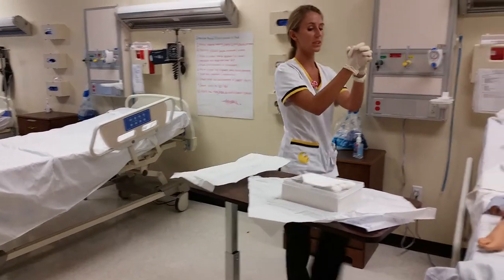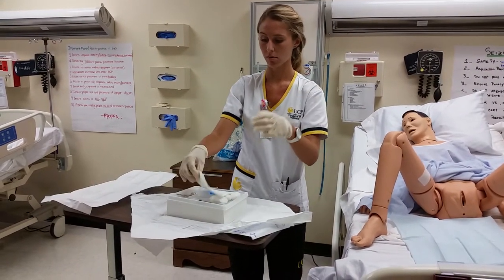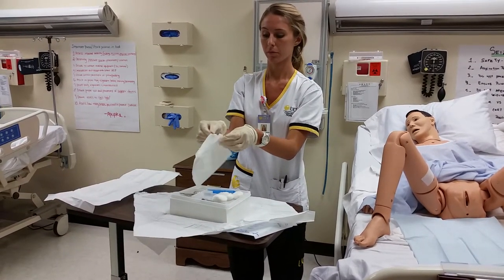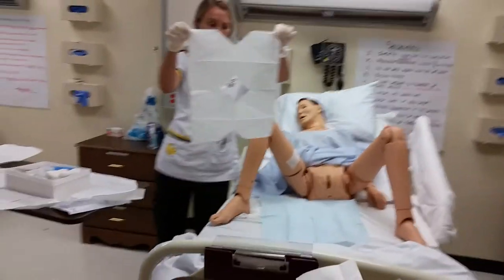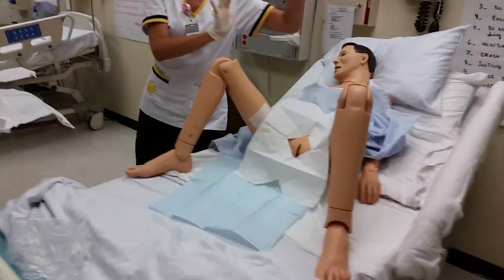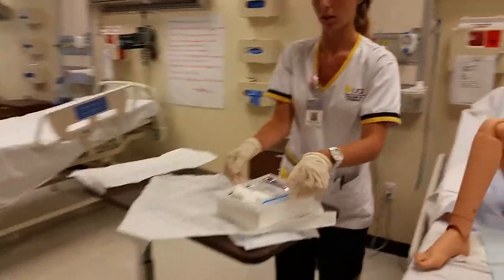Okay, prayer position. Okay, now I'm ready to set up the fenestrated drape. Sterile can touch sterile. Again, being careful not to touch the patient's legs. Now I'm going to go ahead and set up my kit. I'm going to move this.